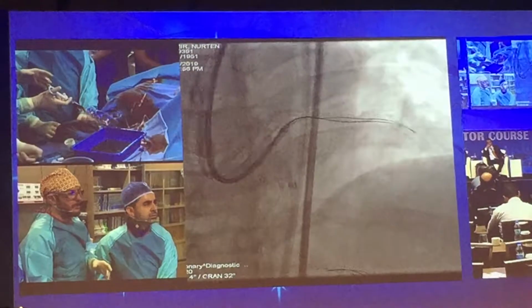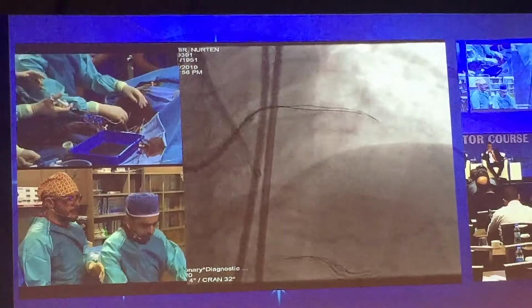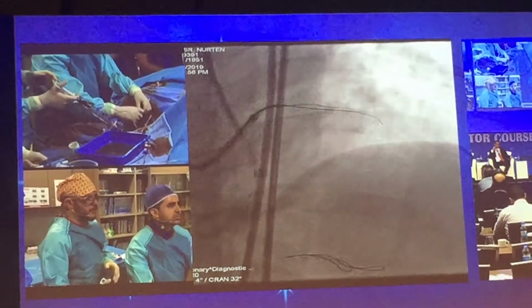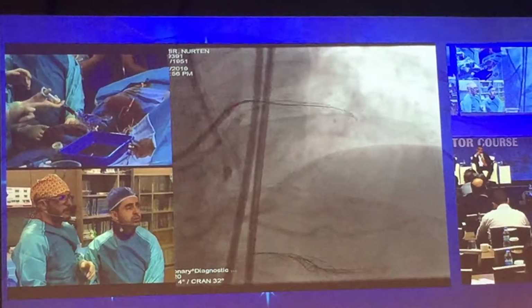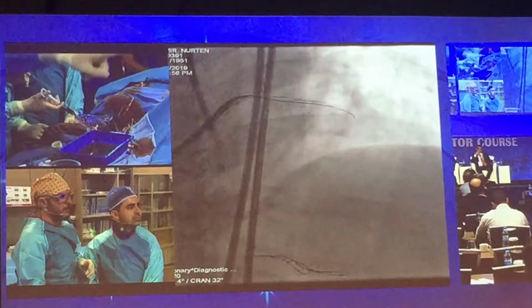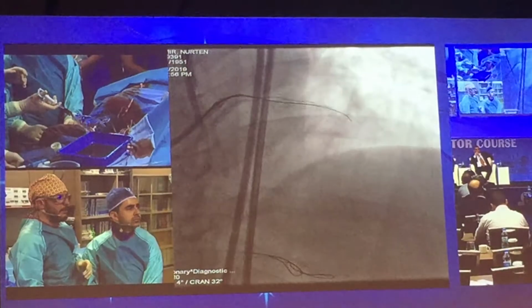Also, we should keep in mind that this in-stent restenosis is the fifth PCI procedure, and probably the reason is malposition. I agree with Dr. Tarık. We should use penetrating wires first to engage the proximal cap.